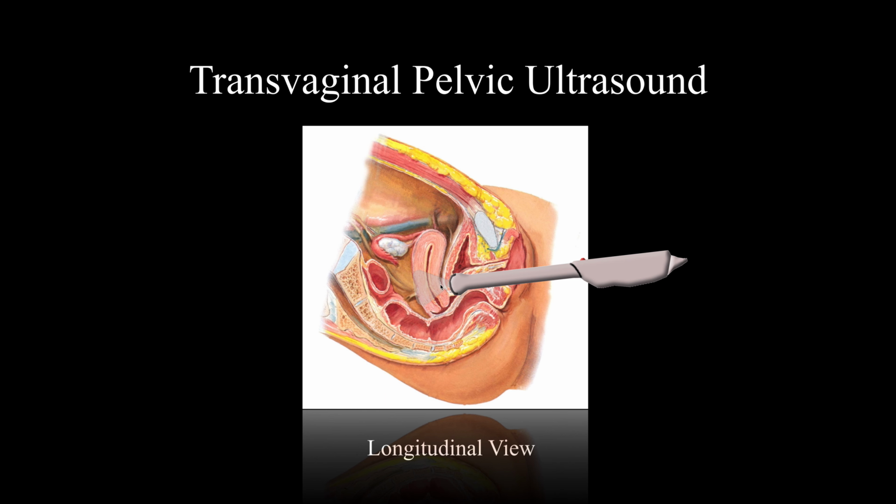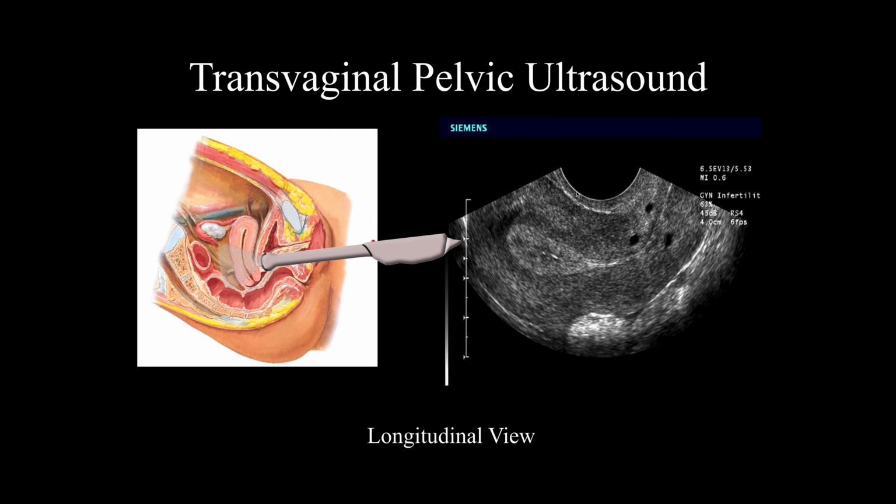Because you're not looking that deep, you can only see this far, because this is a very superficial probe, and it'll look something like this.